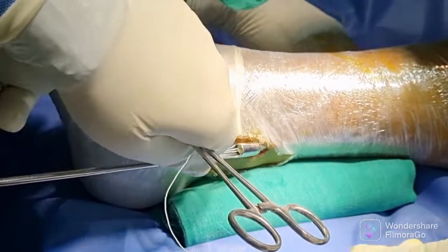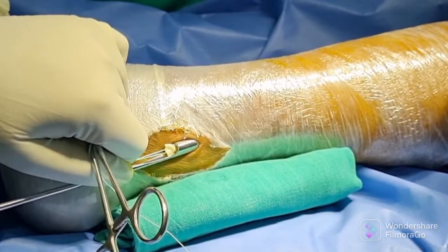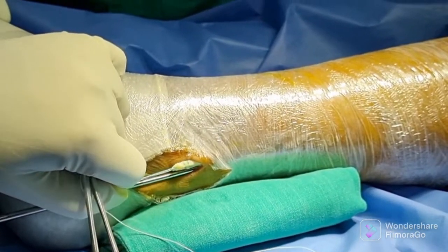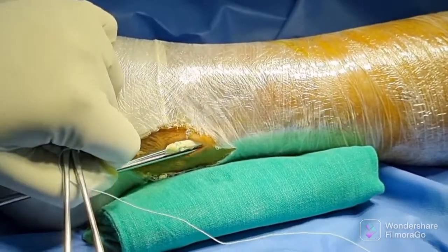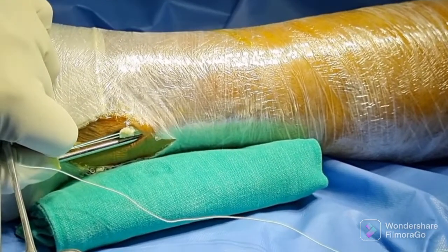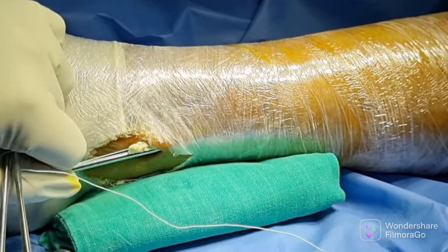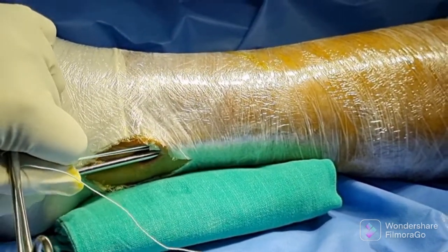Be careful at the proximal part where the junction of one-third and two-thirds is located. Once the tendon negotiates that plane, it will divide the whole tendon into one-third and two-thirds. Direct your tendon stripper towards the fibular head and gently nudge it out as you do in a complete peroneal tendon autograft harvest. Be very careful of your direction in the final proximal one-third of the tendon length so that you do not prematurely detach the remaining part.